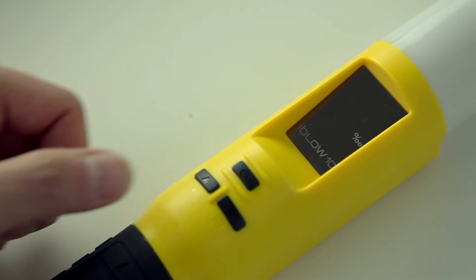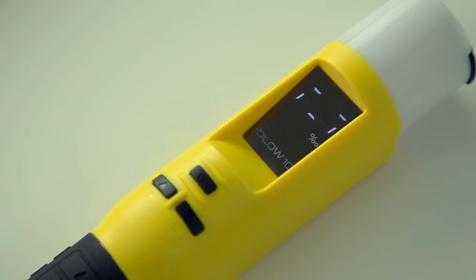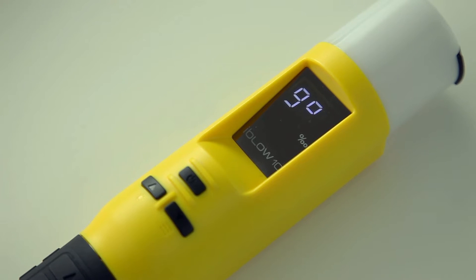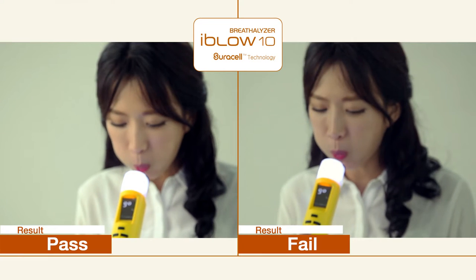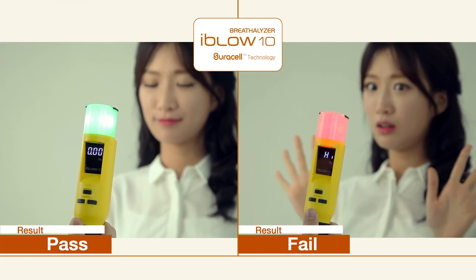Once the batteries are in, press and hold the power button for two seconds until L-000 battery levels and a warming up message is indicated on the display. When the window indicates GO, it is now ready for testing. The subject must then maintain a two to three centimeter distance from the blow cap at the top of iBlow 10 and blow lightly as if blowing out a candle. Then iBlow 10 will quickly analyze a breath sample and display the test result on the display.